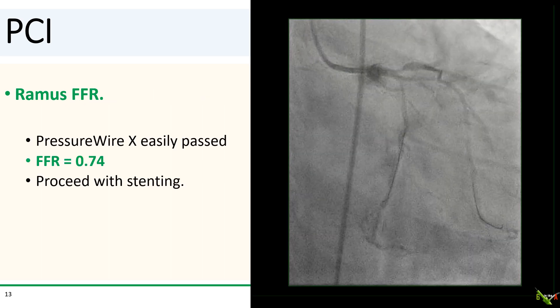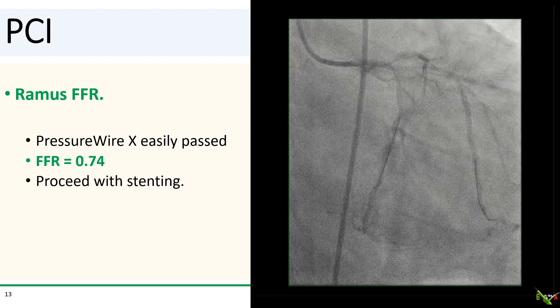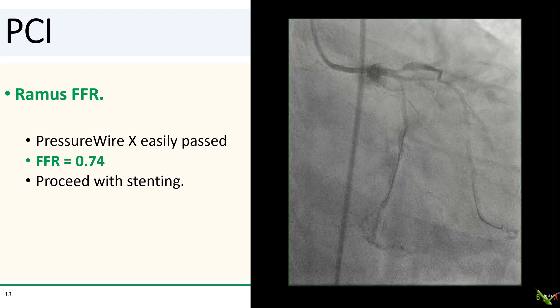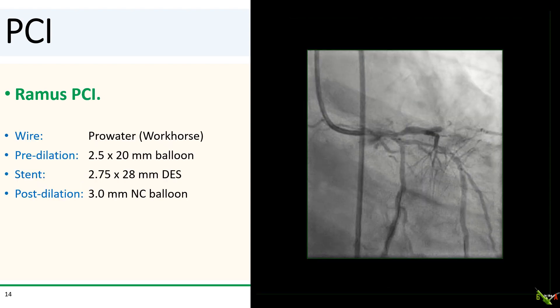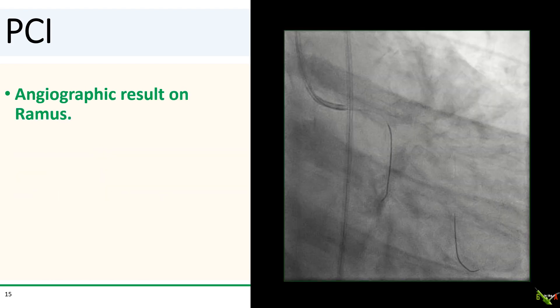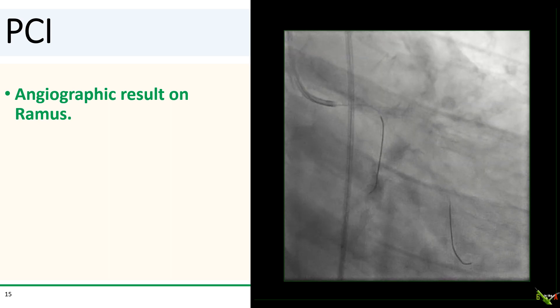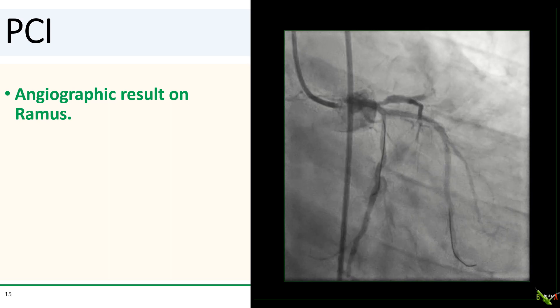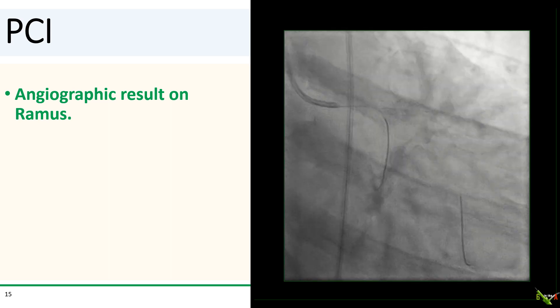Next, following our plan, we did FFR in the ramus. The FFR was 0.74, so we decided to go ahead and stent it. PCI of the ramus was also straightforward, another balloon-stent-balloon affair. After a 2.75 by 28 millimeter DES in the ramus and post-dilation with a 3.0 millimeter NC balloon, the result in the ramus was also quite satisfactory.